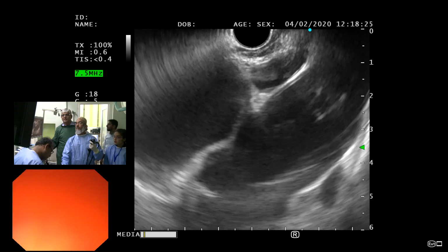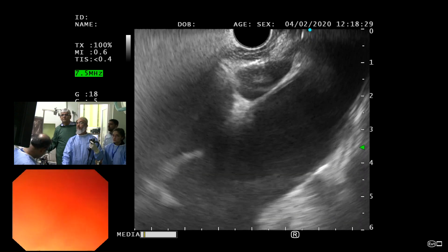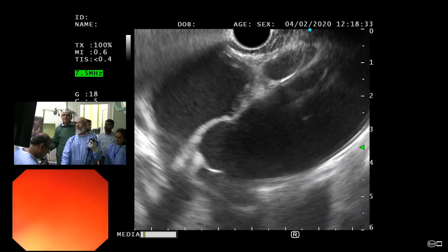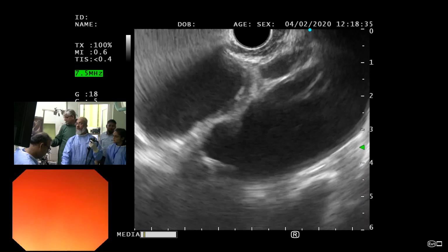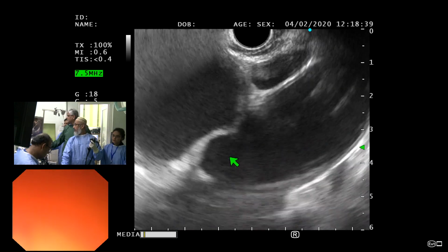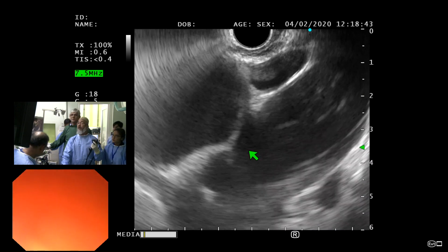So you've got area 7, right? Big wheel, tip up, air out, and advance a little bit. Yeah, that's it. So that's left atrium on the left. ठीक है. Left atrium here, pulmonary artery here. This is the area 7, okay? Or subcarina.